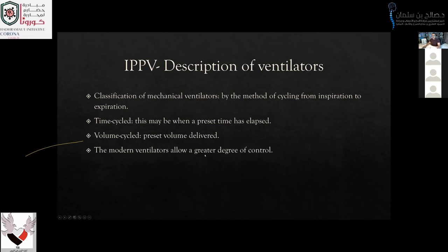The modern ventilator allows a greater degree of control. It is like the professional camera. When you put it in the manual way, you can deal with each single function alone as the need of the patient.